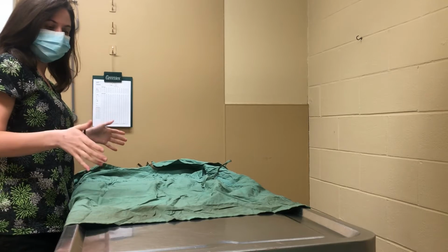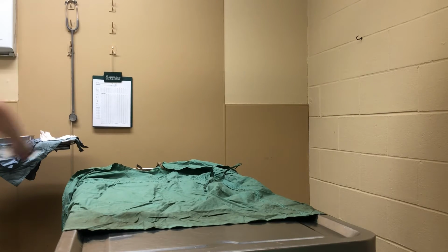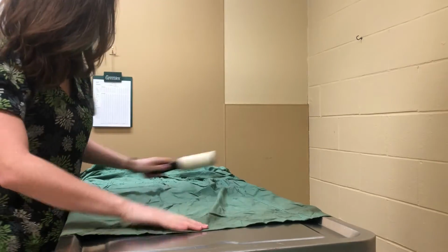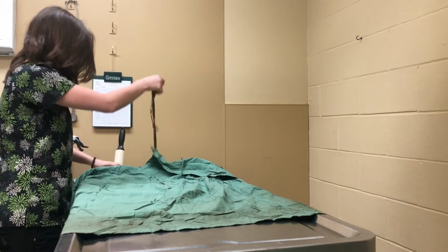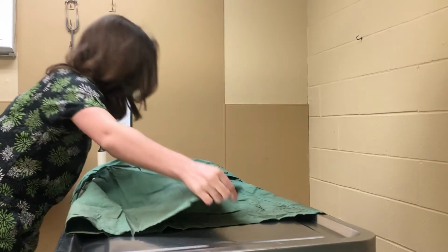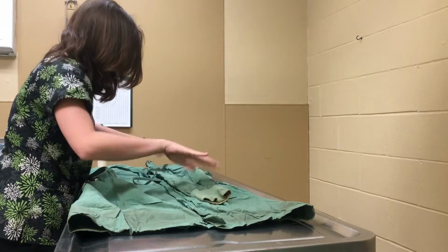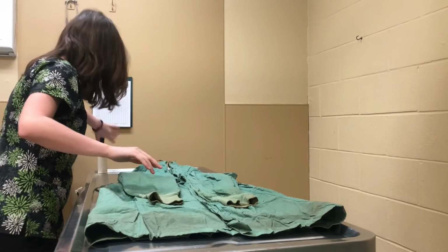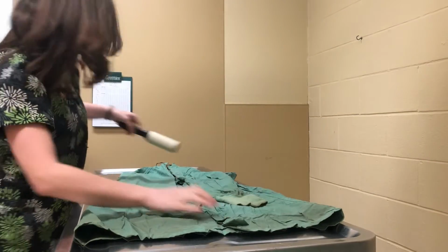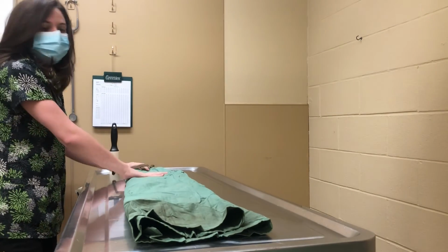So I'm going to demonstrate how to properly fold a surgery gown. So first thing we're going to do is I'm going to take my lint roller, and I'm just going to go over the gown, make sure that there's no tears anywhere. Next I want to find my 2 neckties and just keep that out of the way. I'm going to fold the gown into 2 halves, either side, and I want the sleeves also folded in. Before I do anything else, I'm also going to go over it again with the lint roller. And then I'm going to fold it in half again and put our 2 ties right on top. I'm going to fold it into an accordion.